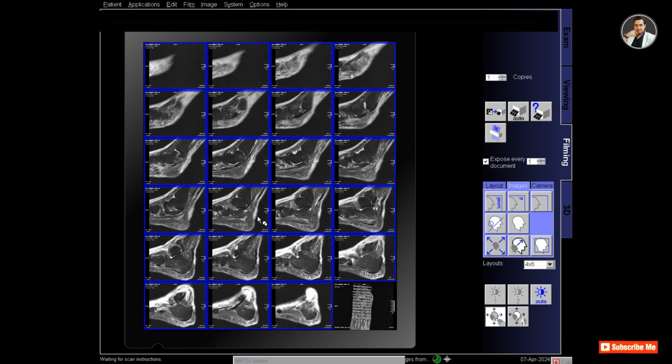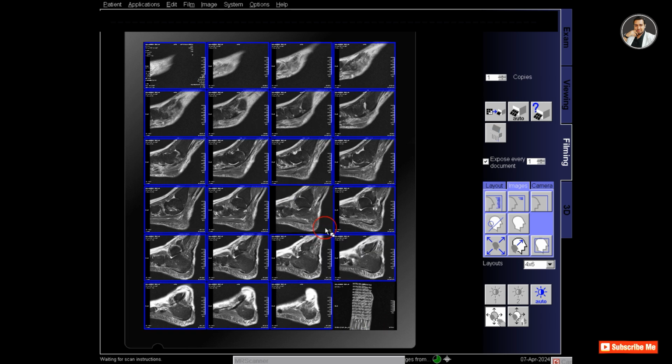Adjust the contrast of the image and zoom pan so that the images are fitted in the segment. And make sure that the patient information is in at least one segment. I prefer the first segment to give all the information of the machine, the parameters and the patient.